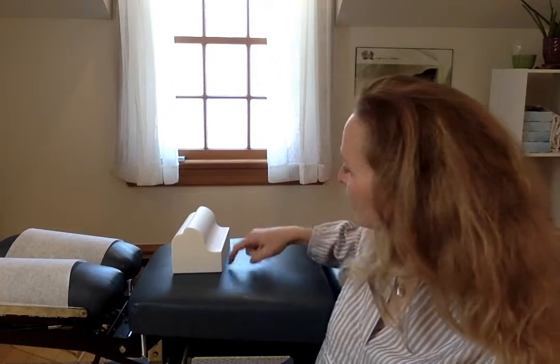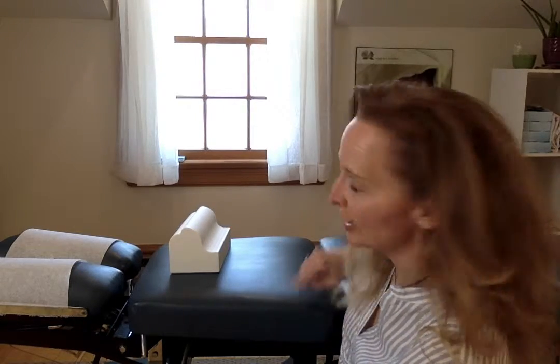For you, when you're at home, you're going to do this on the floor. Don't do this on the bed or on a couch. It's too soft. So lay a yoga mat on the floor if you need to. If it's hard, or if you're on the carpet, that's fine. But you're going to put this right on the floor, and you're going to make sure that where it says shoulders this side, that's where your shoulders are going to go. So your feet are going to go down from here.